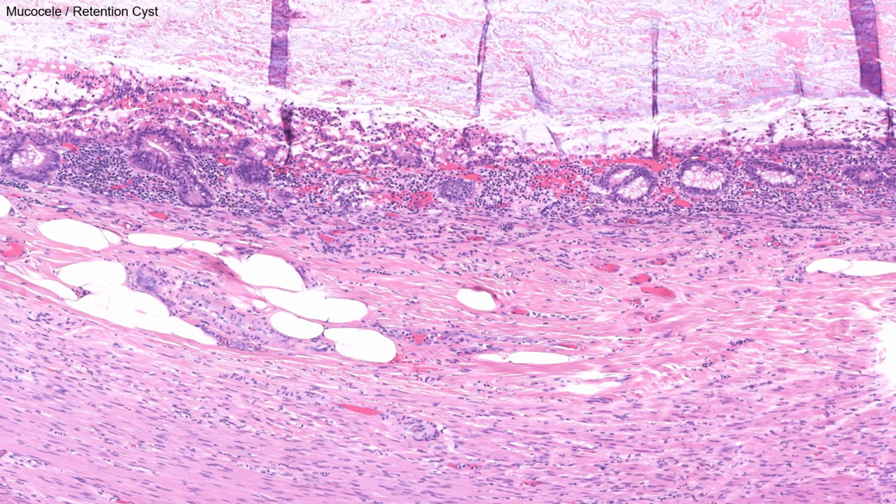At higher magnification, we can see that the mucosa still has some crypts. They appear injured, but they do not appear dysplastic, and we have preserved lamina propria and muscularis mucosae, telling us that this is definitely not a LAMN.